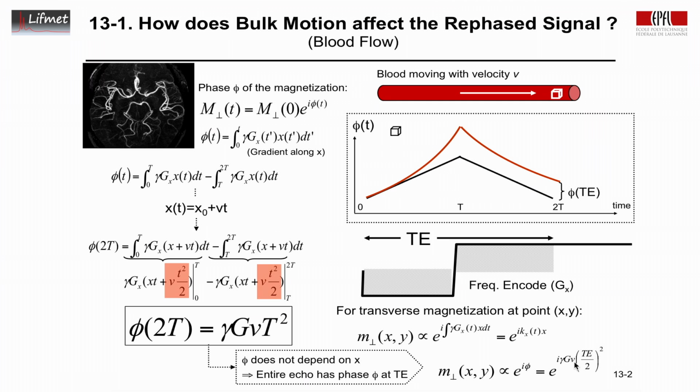So obtaining images like this is one way to obtain an encoding of a velocity in the voxel. For such an image, one can obtain the encoding of the velocity, not just the velocity, but also the direction, which is along the gradient, by simply recording the change in phase compared to stationary magnetization with appropriate reference scans. So we see that motion affects the phase of the voxel.